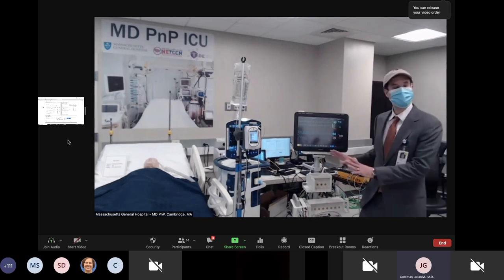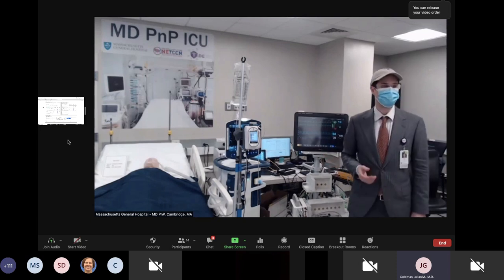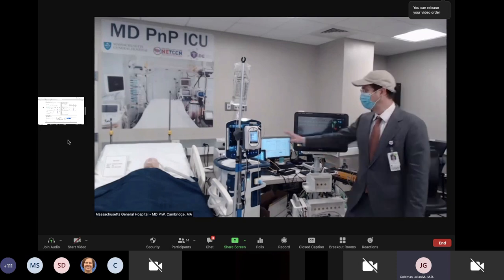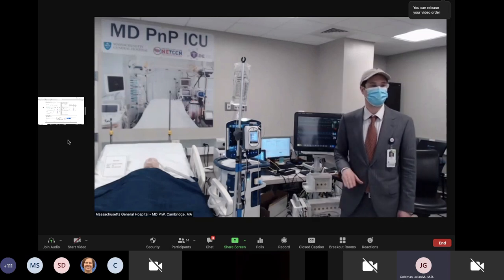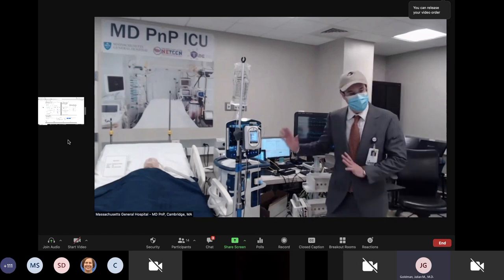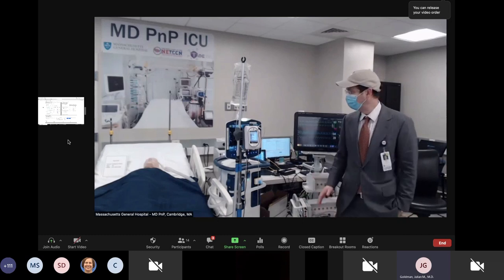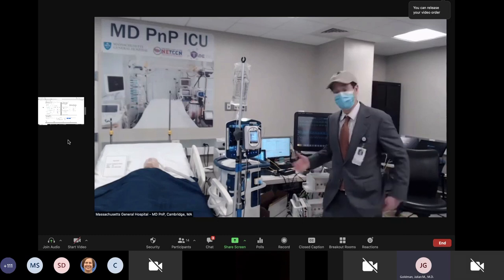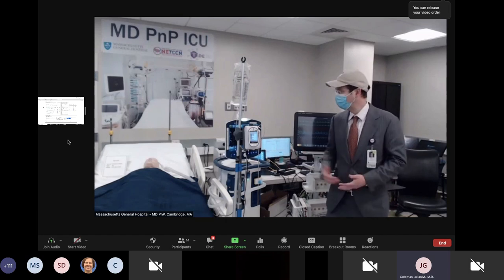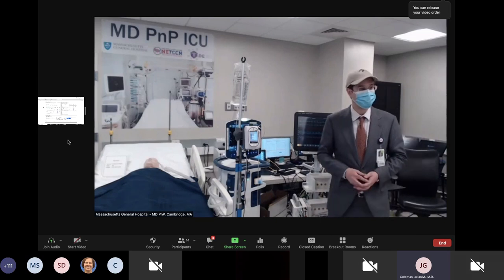These devices are connected through two parallel systems. All of the devices are connected to our OpenIce research interoperability platform, and the ventilator is also connected to a Medtronic remote control software for non-clinical use here in the lab. So, having set the stage, we'll now start our scenario. So I am the nurse in this room. I'm not very familiar with this particular ventilator or how to change it or how to help this patient, but I know that their oxygen saturation is low and that their blood pressure isn't great either. So I'm going to call for a remote teleconsultation and ask for some help.